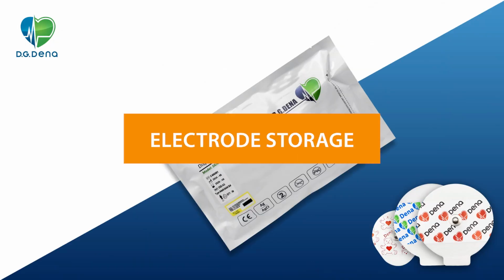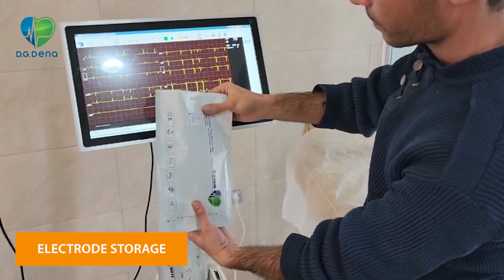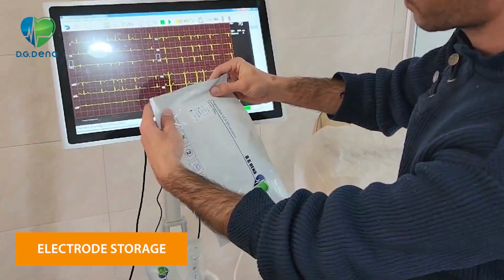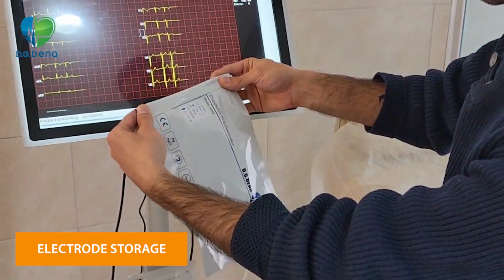Electrode storage. When using bulk packaged electrodes, store unused electrodes in their original foil packaging. Storing electrodes in drawers or boxes may cause the gel to dry out, leading to signal quality issues.